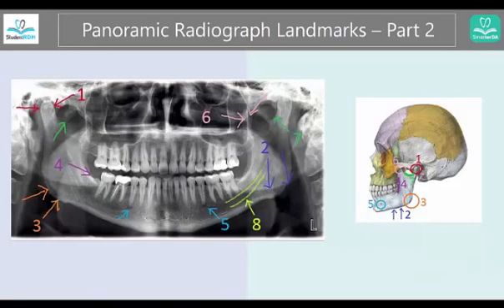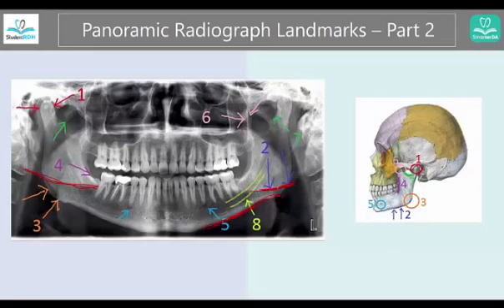Number two is this one. What is this area? The patient is not having any cancer or abnormalities here, but this area looks lighter and there's a weird line. Well, this line is the ghost image of the actual mandible. Those bony structures, when taken with the panoramic x-ray, can be projected as a secondary image — also called the shadow — and that is called the ghost image.